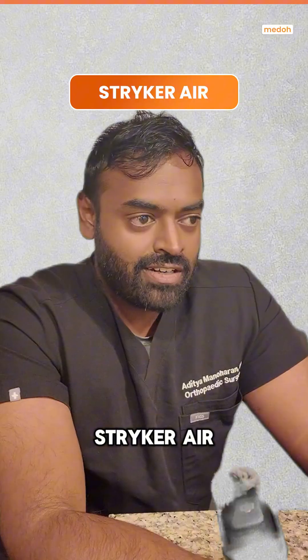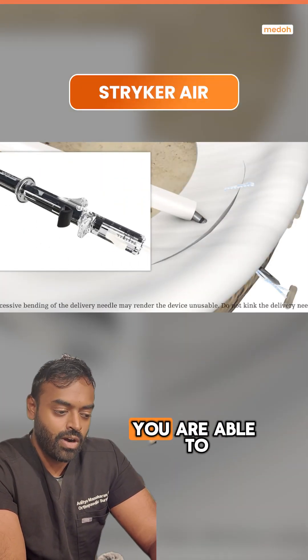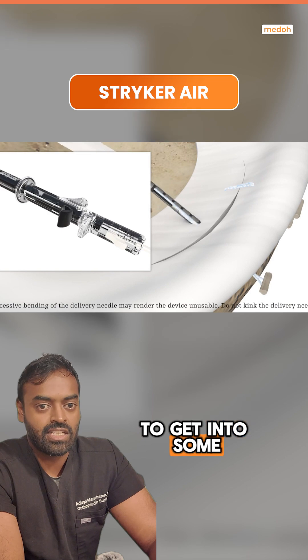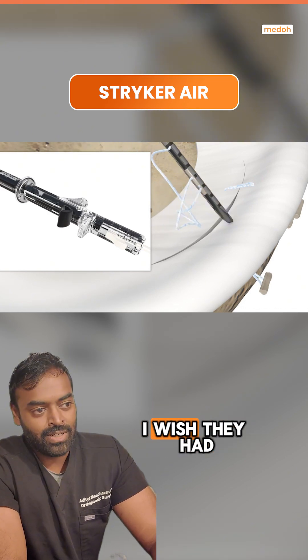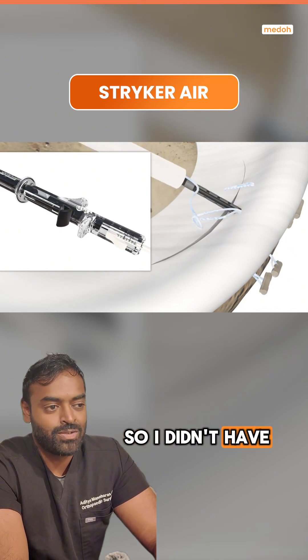Stryker Air — 8 out of 10. I think it's a really good device. You are able to bend that needle to get into some harder-to-reach places. I wish they had more of an all-suture anchor so I didn't have to worry about that PEEK implant.